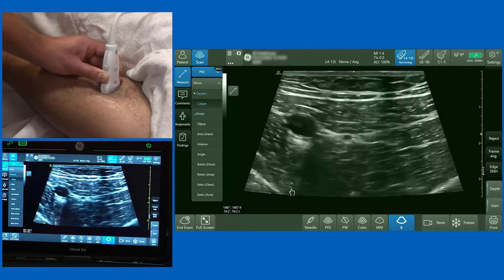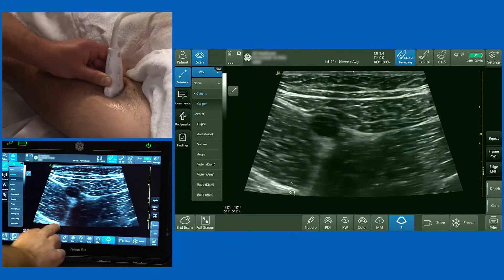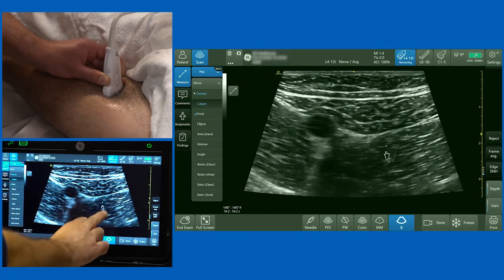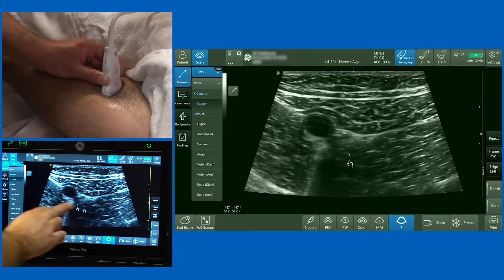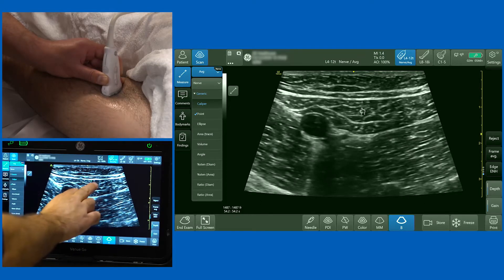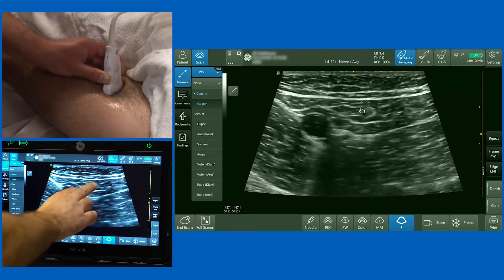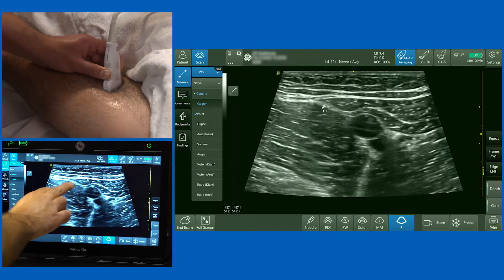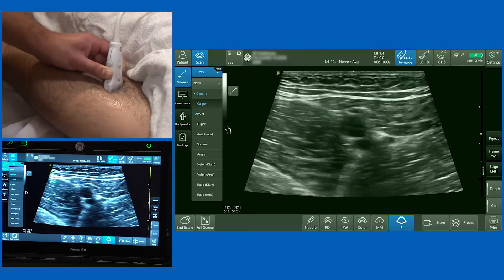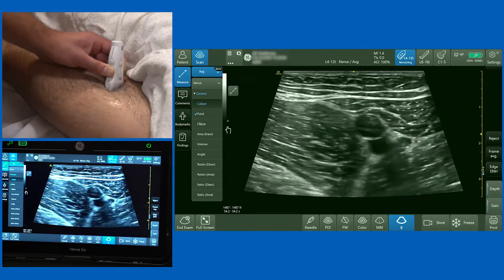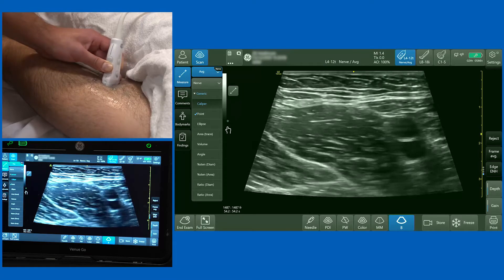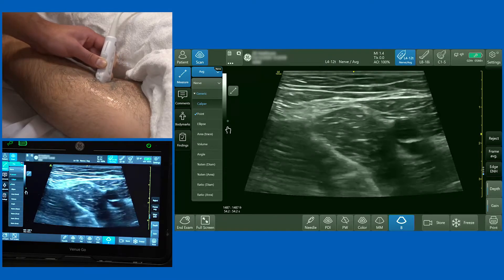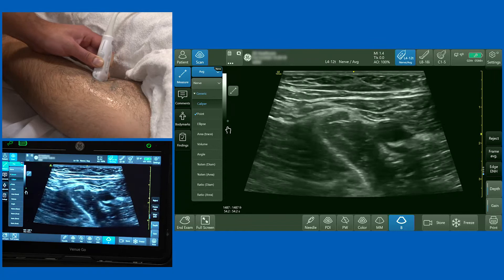If you start high up in the thigh you'll notice the sartorius muscle swings out laterally — this is vastus medialis and this is adductor longus. I'm going to slide the probe medially so I can see the medial border of sartorius, and as I move down the leg I want to watch the medial border of sartorius and see where it meets the medial border of the adductor longus muscle, which happens there.